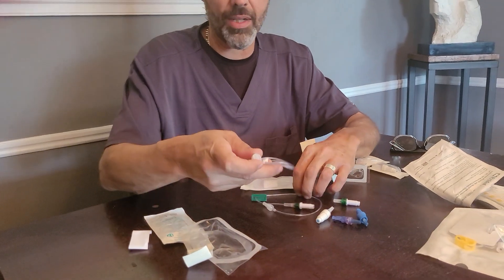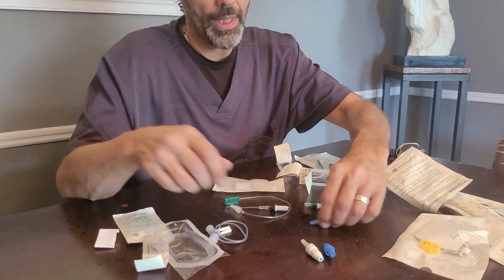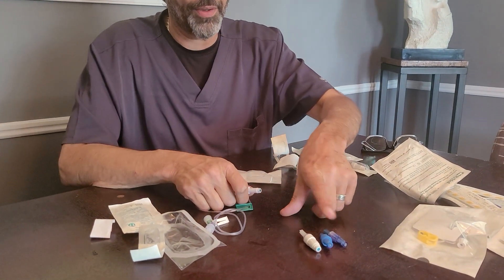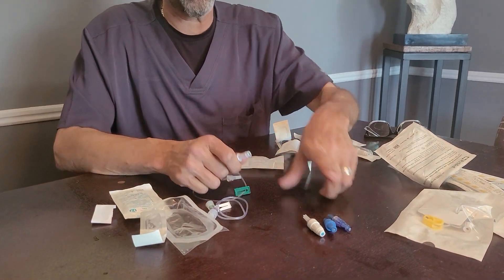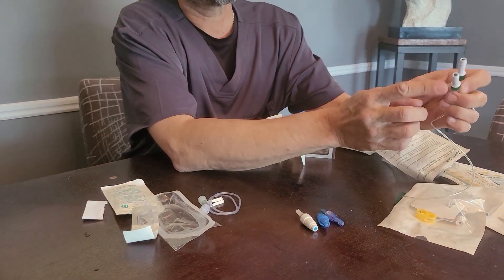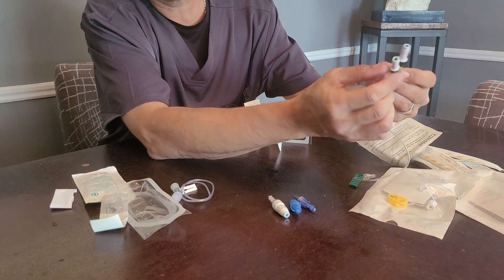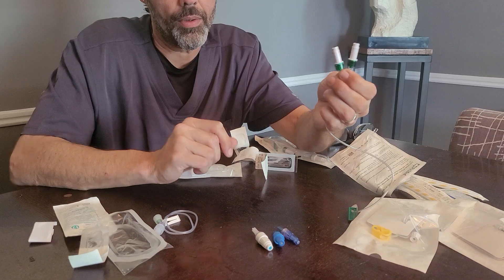Let me go over the differences between the extensions. The extension doesn't even really matter so much as the injection cap. These injection caps all fall under the same category — they are positive pressure injection caps. The caps that are green and white, with the green at the top, even if skinnier, same pattern with the green — these are negative pressure caps.